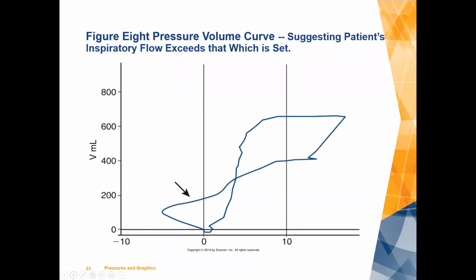The fix here, just everything's obvious if you know it, would be either increasing the inspiratory flow or switching to a time cycle and, if you will, reducing the I time.